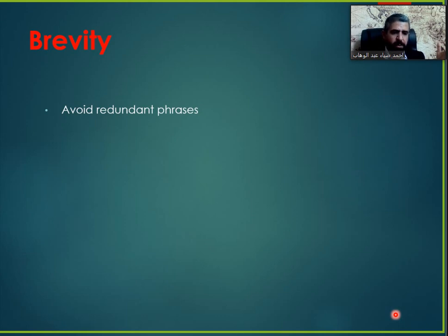It implies that you have examined the bone window, the appropriate window, and there were no bone metastasis. You don't write review of the scan at the bone window. This is redundant. It's extra. No need for that. Okay. You can write the lungs are clear. It means that you reviewed the lung window and they were clear.